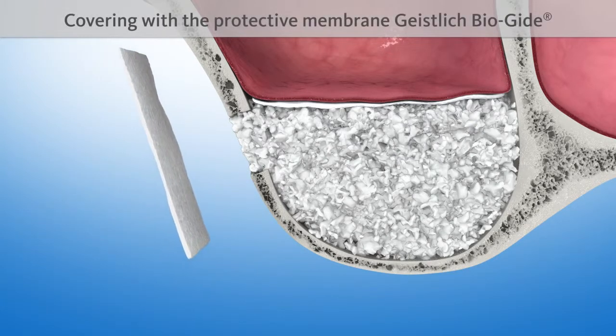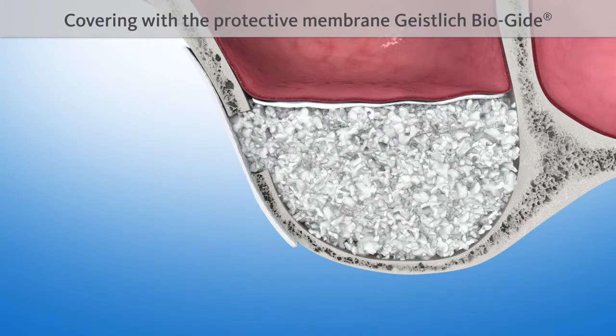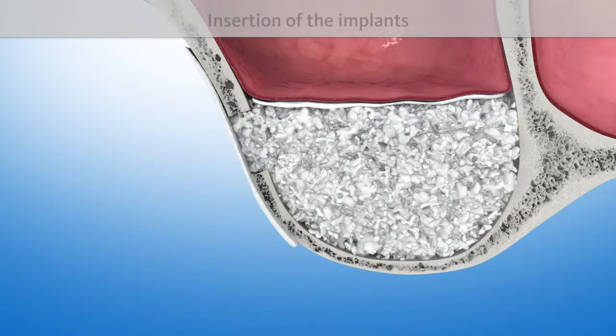The lateral opening is covered with another protective Geistlich Bioguide membrane. Finally, one or several implants are inserted.